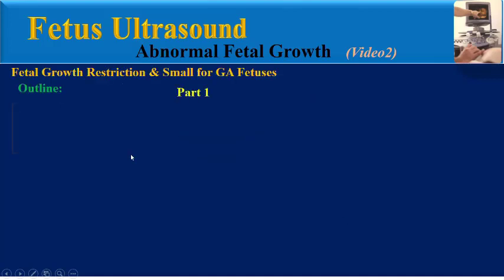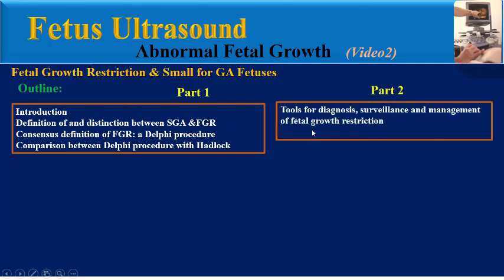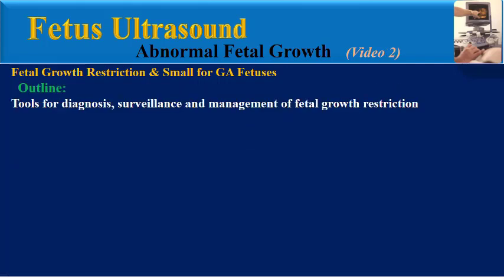In video part 1, the important prerequisites for diagnosis of fetal growth restriction and small for gestational age fetuses were explained. In video part 2, it will be explained which tools are required for diagnosis, surveillance, and management of fetal growth restriction.